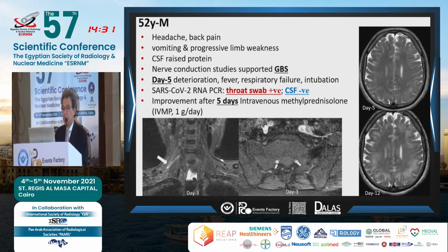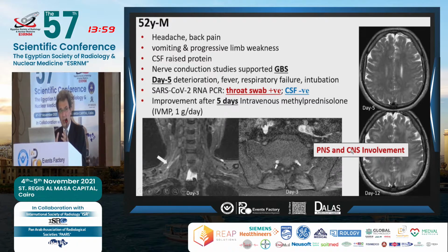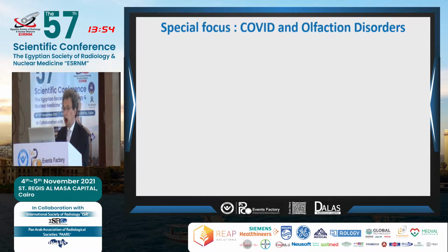And on this one, the patient had a positive throat swab, but a negative CSF for COVID. And if you see here, we have a hyperintensity of the brachial plexus and also here of the nerve roots, and also some diffuse hyperintensity in the brain. So we have two areas of changes in the peripheral nervous system and in the central nervous system. So this is also where the 5 categories that I mentioned initially of the neurological syndromes come in.